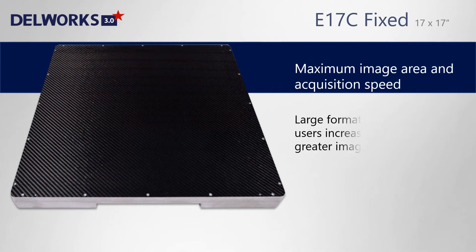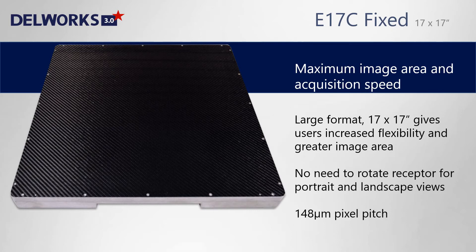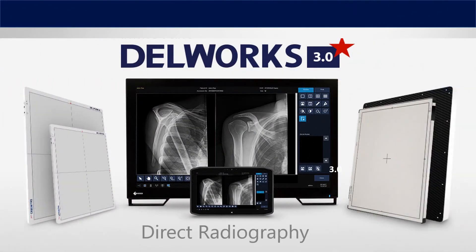The E17C fixed detector has a full field image area of 17 by 17 inches. It can be installed in the wall stand or the table, and requires no rotation from portrait to landscape. DellWorks 3.0 by Dell Medical — powerful and efficient digital imaging.